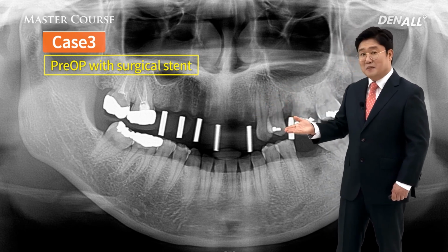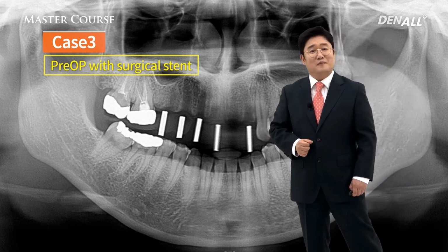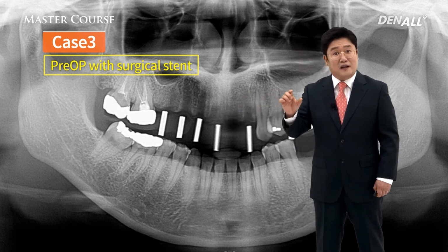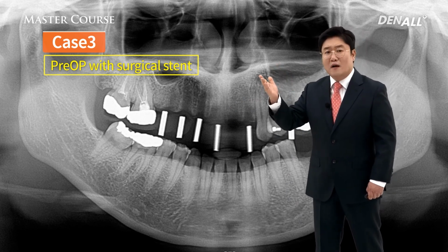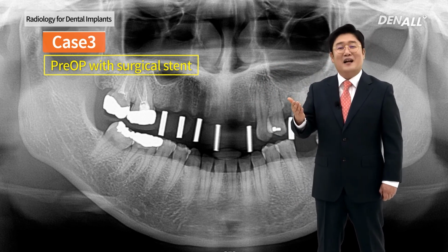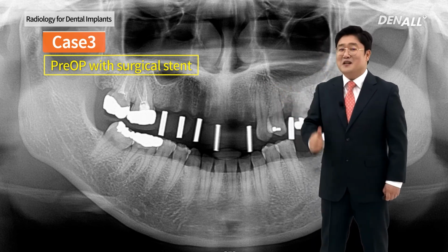You can see metal rods. Implants will be placed in those locations. The metal rods, we know the length accurately. Therefore, the degree of distortions, the vertical magnification, can be exactly identified. Therefore, implant diameter and length would be chosen.